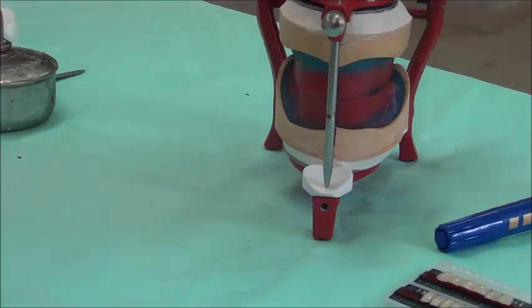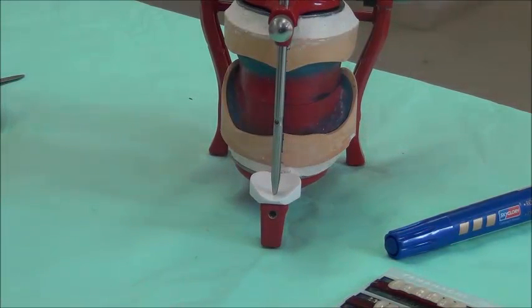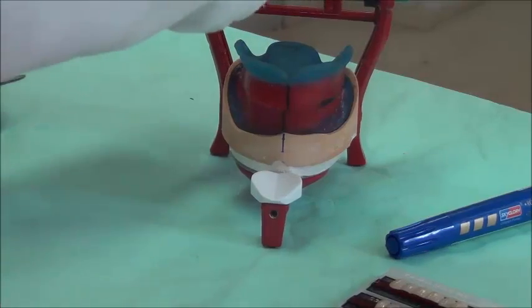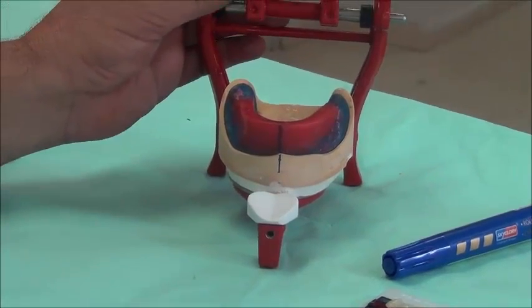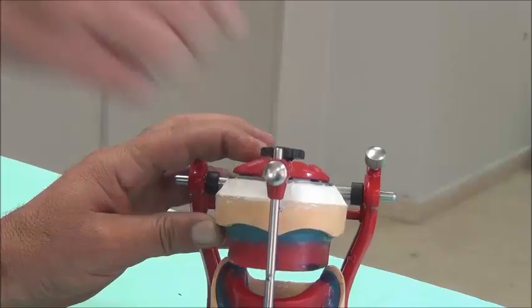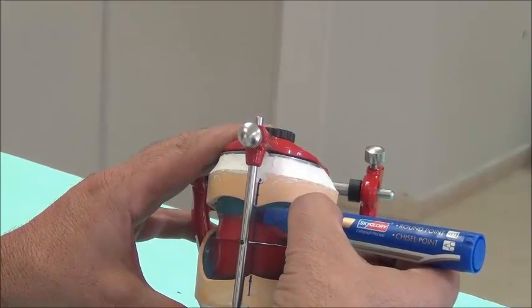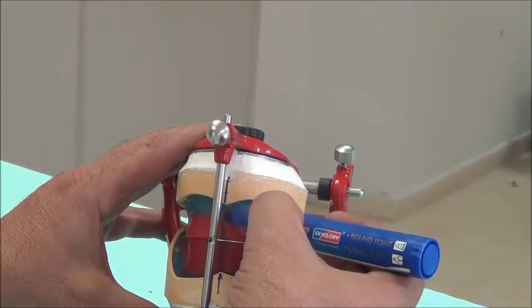The first step is to draw the midlines and accentuate them. Then we want to emphasize the arch of the wax. If we remove the upper and look at the wax, we find that the wax has an arch that is like a U shape. We want to keep the setting of the teeth within this arch. We use a pen to draw a line and make sure that the wax arch is clear, and the midline is clearly marked.